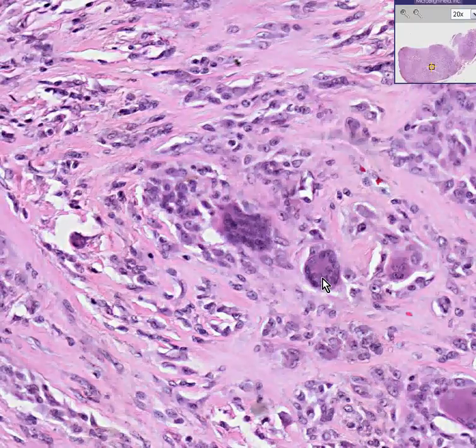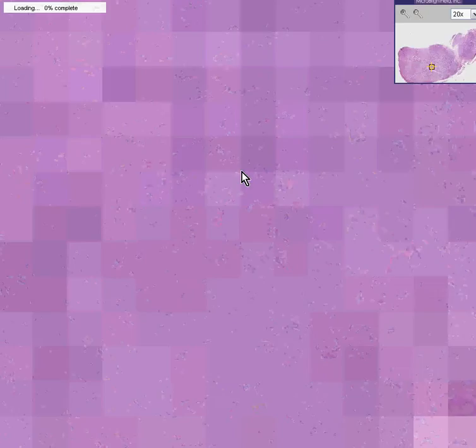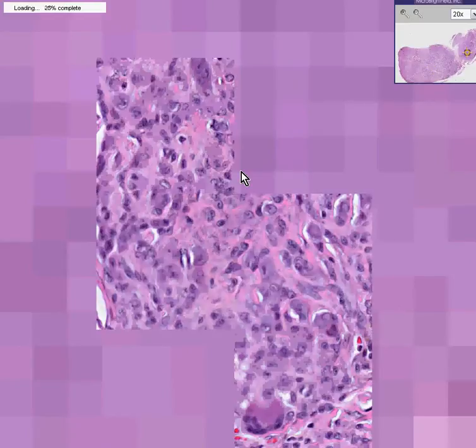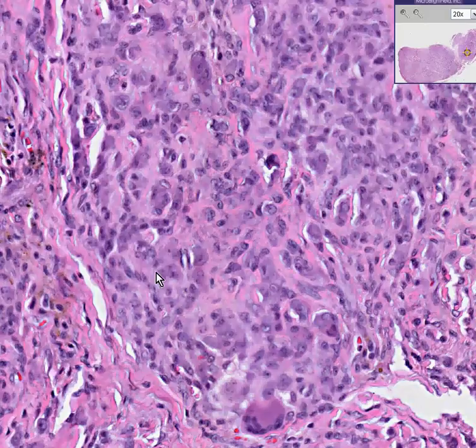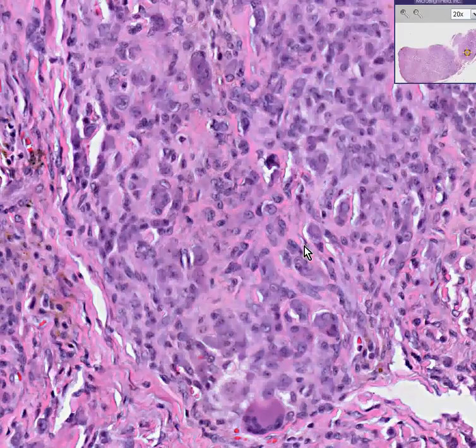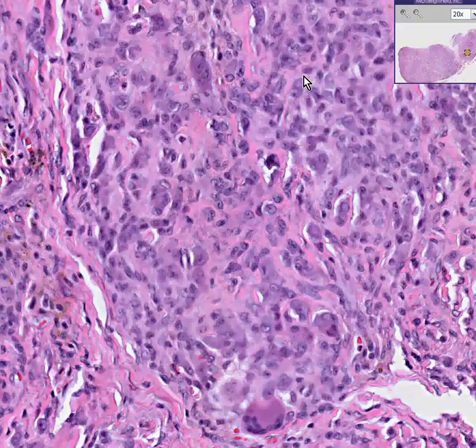Just like we see with granulomas — TB, foreign body, fungi. Let's go to another random area here on high power. Here's a giant cell. Here's some of the cells that are not forming giant cells. Notice this little slightly refractile pinkish stuff between the cells is pure collagen as well. So fibroblasts are part of the tumor making collagen. The synovial cells out here have proliferated in a neoplastic fashion as well as the giant cells.